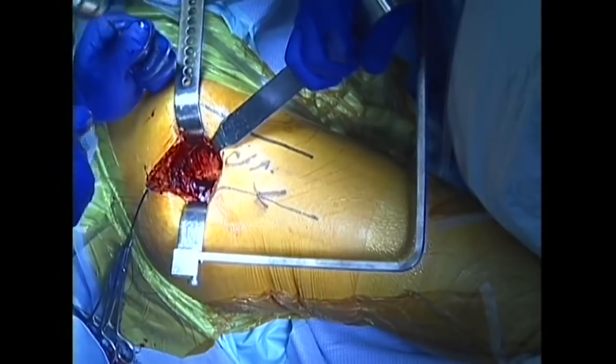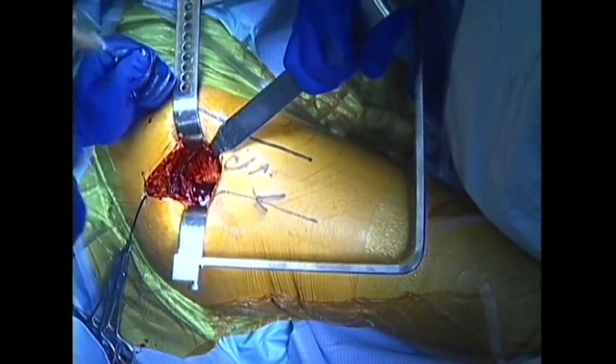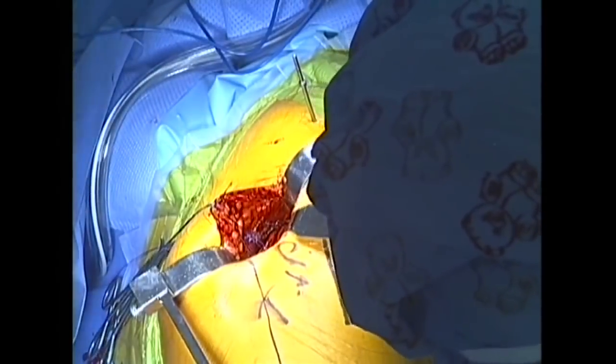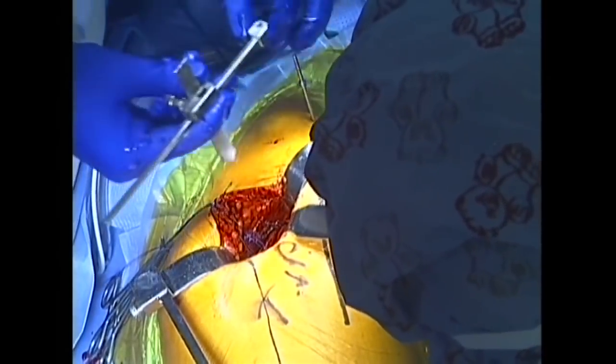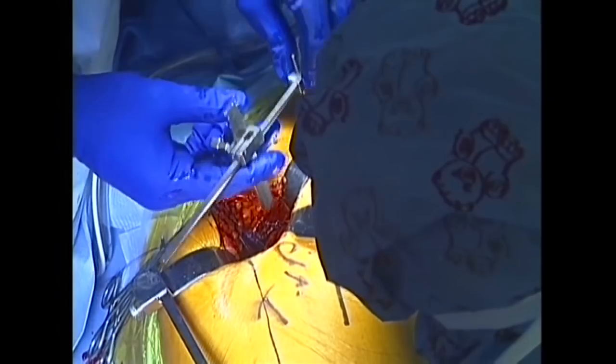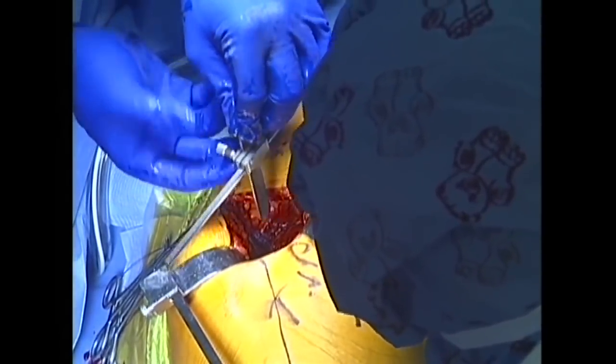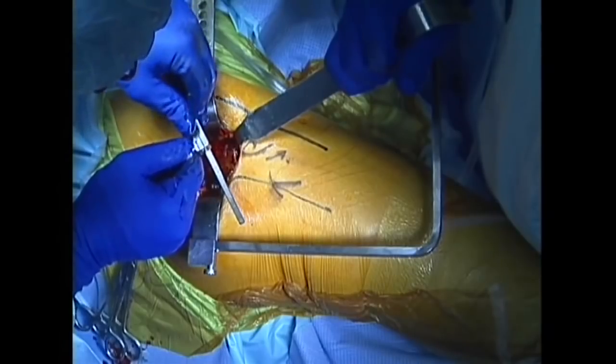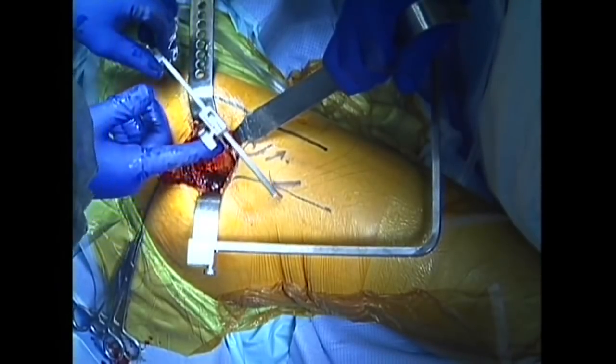A pin is placed into the pelvic bone. This pin will be used as a reference point to determine appropriate hip position during hip reconstruction. The anatomic position of the hip is then measured, which will serve as a reference measurement during reconstruction.